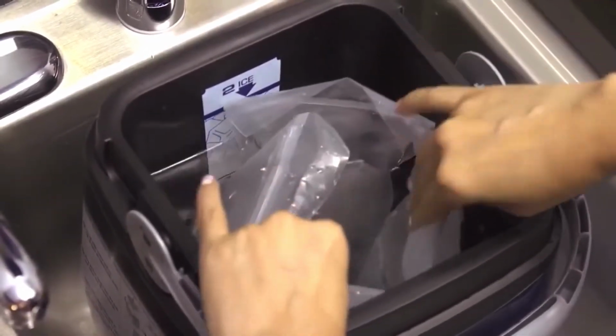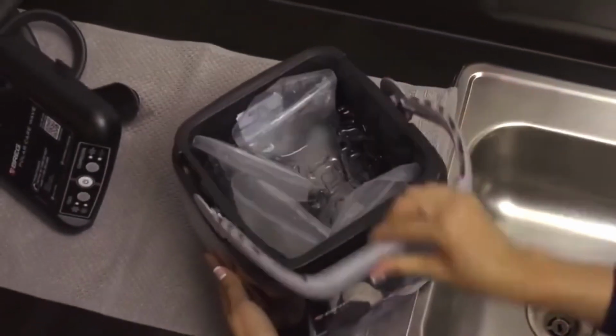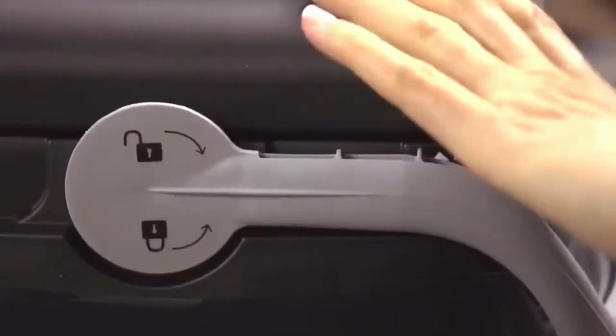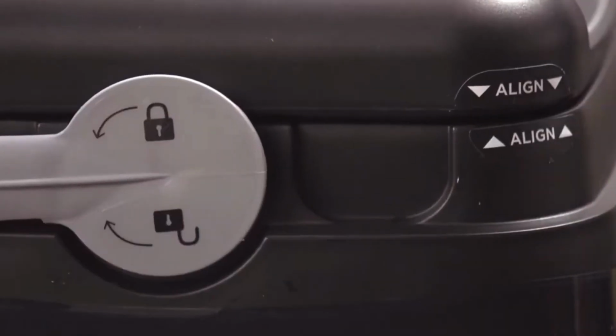While using the BREG ice bags, cubed ice may be added to the container up to the ice fill line to optimize the colder setting. With the handle in the unlocked position, place the lid on top of the Wave container using the aligned stickers. Once the lid is in place, rotate the handle into the locked position.